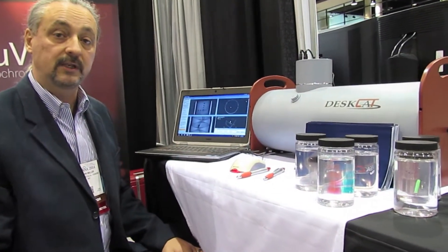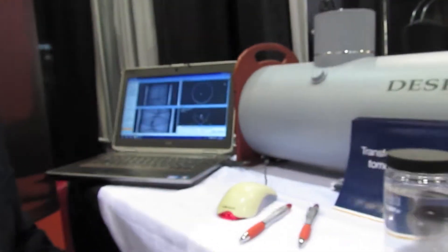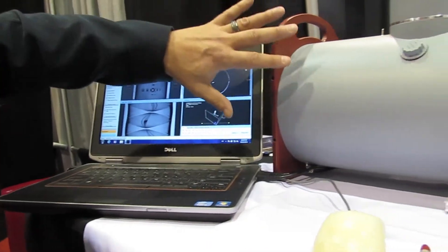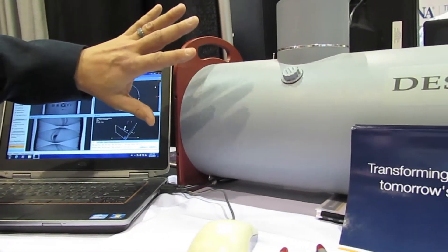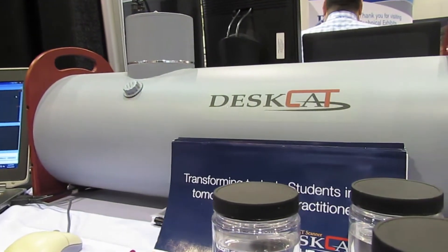Hi, it's John Miller here at the RSNA in Chicago in 2014. This is the DESCAT scanner, it's an optical CT scanner for education. You can see the software. The scanner is optical so there are no x-rays, there's no damaging ionizing radiation danger to the students or the instructor.